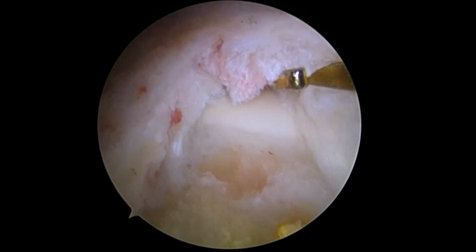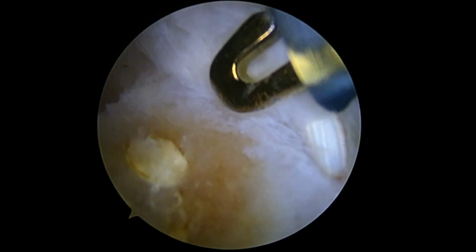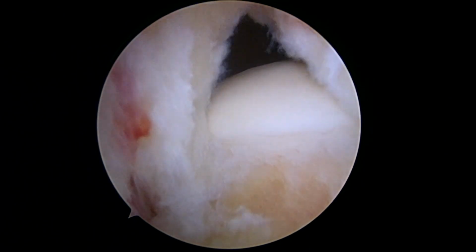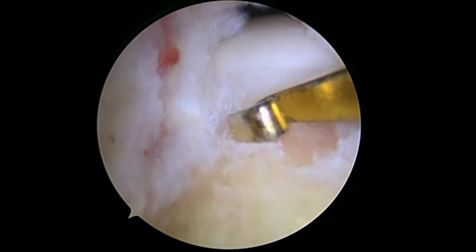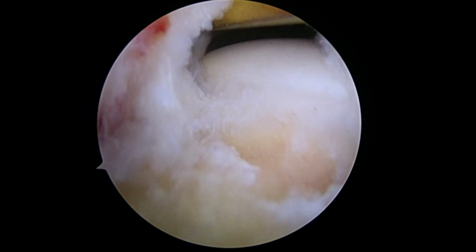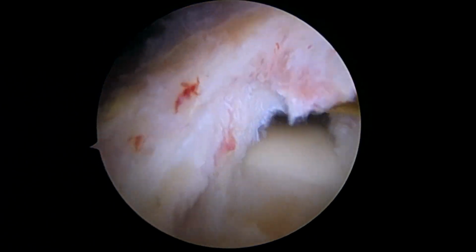Okay, so here's the tear. This is your biceps tendon right here, right there. And then this is where the tear is, just posterior to it. And so we've unroofed it. We can see that the tendon really inserts back at the articular margin right about there, so I don't think I need to go any farther posterior. That looks pretty good. I just need to make sure I get the full thickness of this.